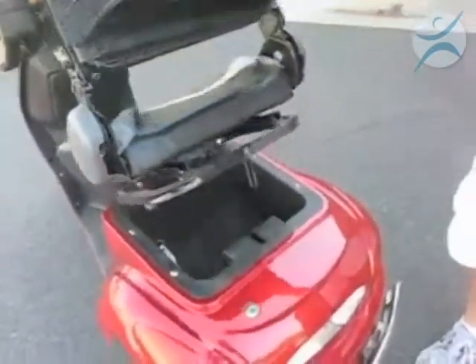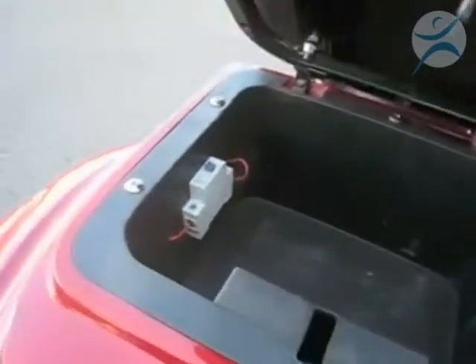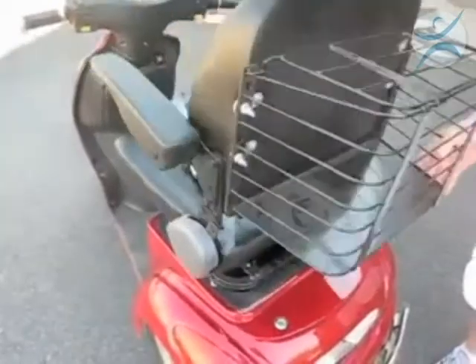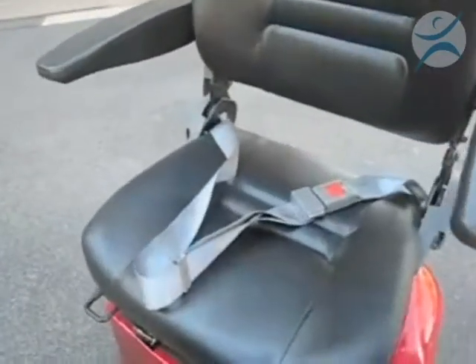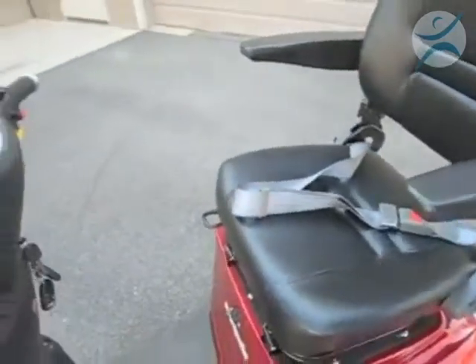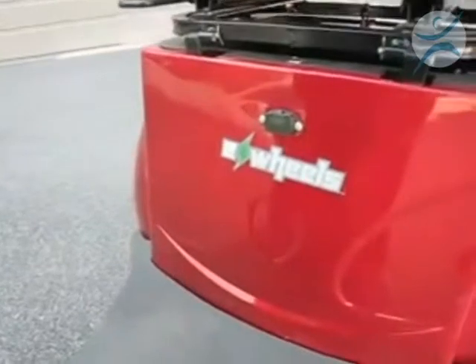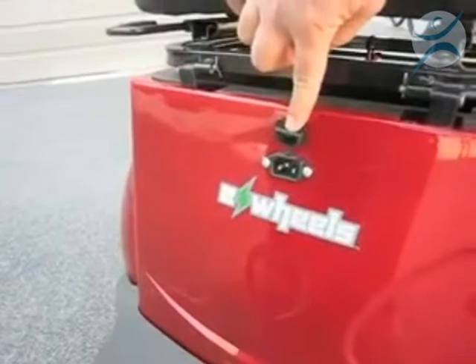Underneath the seat is a lockable storage compartment. We've also put in a fuse for a shutoff, so you can actually shut that fuse off if you're not using the scooter or if you just want to secure it. The EW36 also comes standard with a very safe seat belt. The charging port is located directly underneath the seat — you just plug the charger cord into this port and it easily charges.